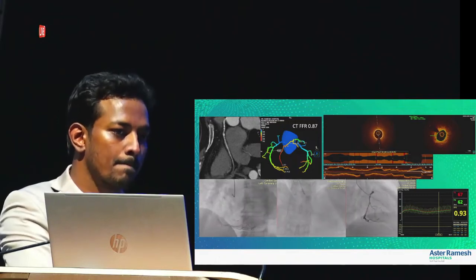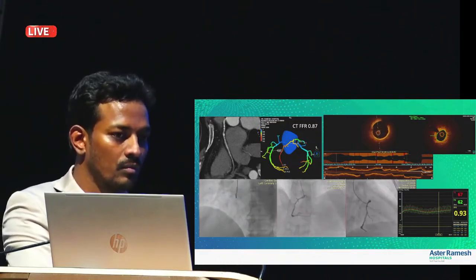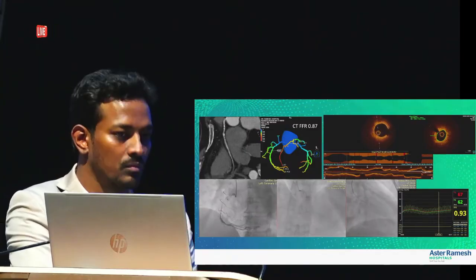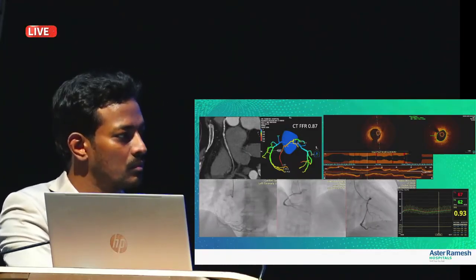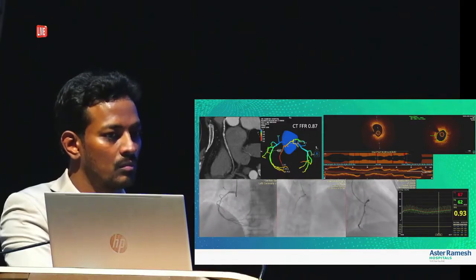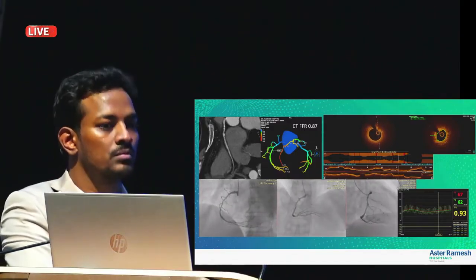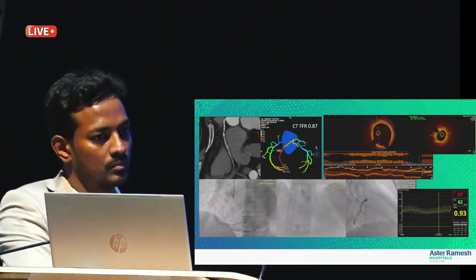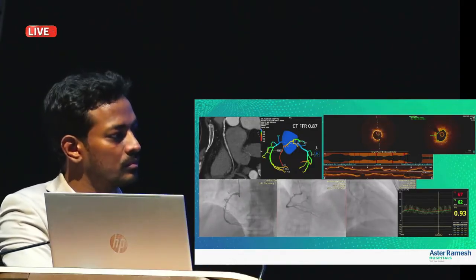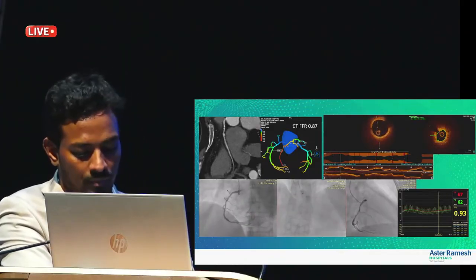So all these factors put the patient at high risk, and more importantly, if your OCT value were something like around 3.5, then probably very aggressive lipid lowering and so on. But leaving this lesion in an active patient without doing anything, we were not very sure. Still, we gave the shared patient decision, and that's how he went for a PCI. Yeah, it's the right approach.